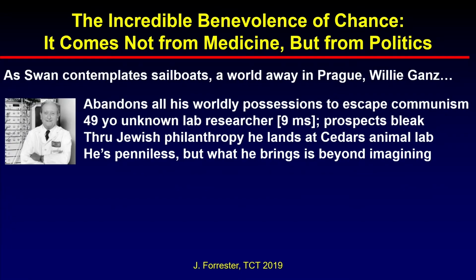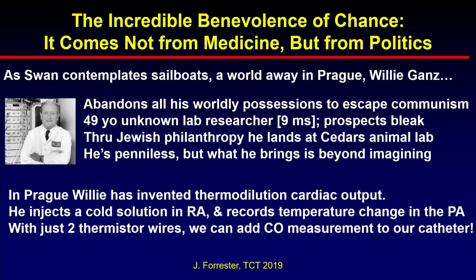And this story of the Swan is in some ways very similar to how we have to manage these patients. It's individualized care. This is how the Swan came about, how hemodynamic profiling came about back then. We don't want to throw this away, the history or the collaboration, but we do need to recognize that one size does not fit all, and we have to be good clinicians to take care of our patients. Thanks so much.